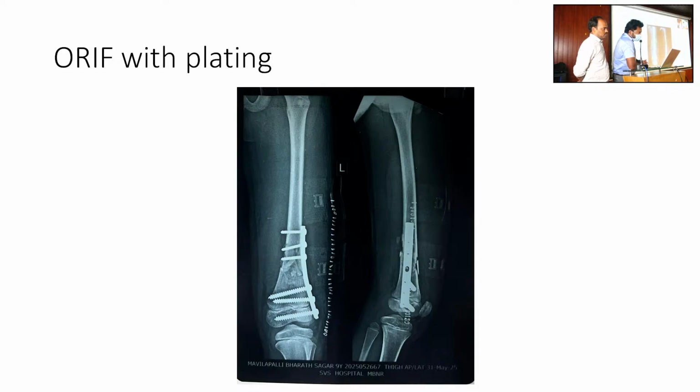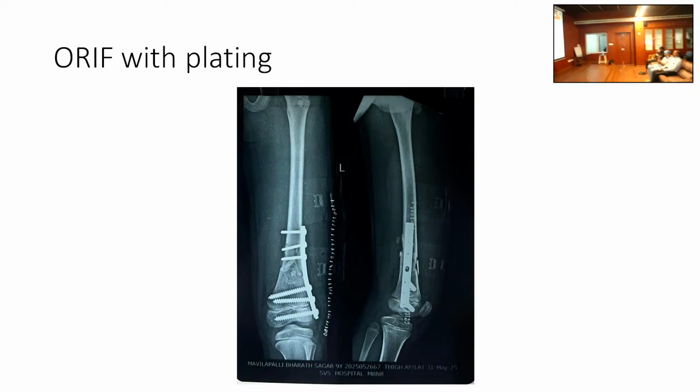Length you wanted. Otherwise, the distal end of the plate might get diverted. Correct, but for better contact. Why do you want to do it? In a 9-year-old boy, the vascularity of the bone will be very good. They heal very fast, provided there is no infection at the fracture site.